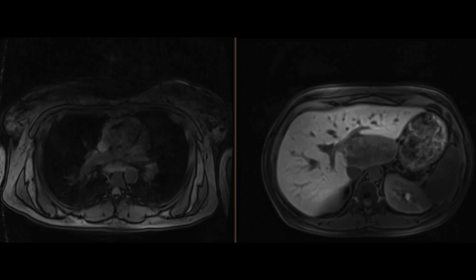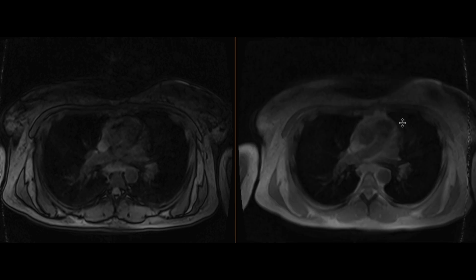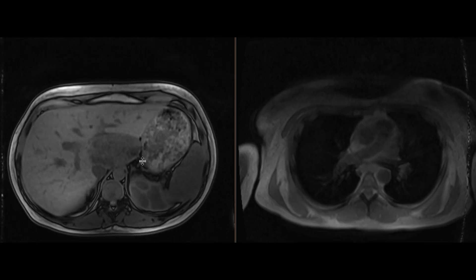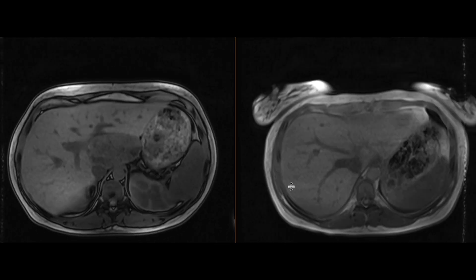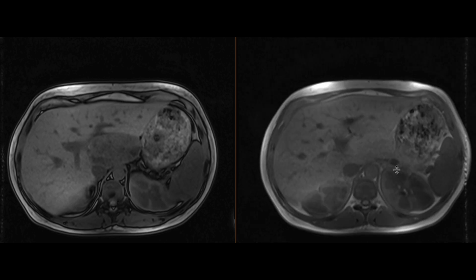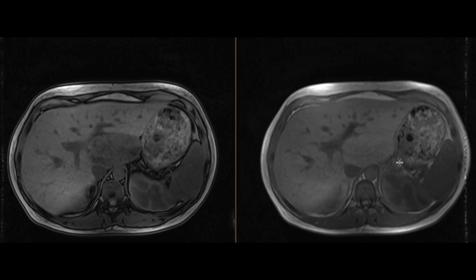Finally, on the in-phase and out-of-phase sequences, we can see that this mass clearly loses signal on the out-of-phase sequence, which tells us it contains lipid within it.